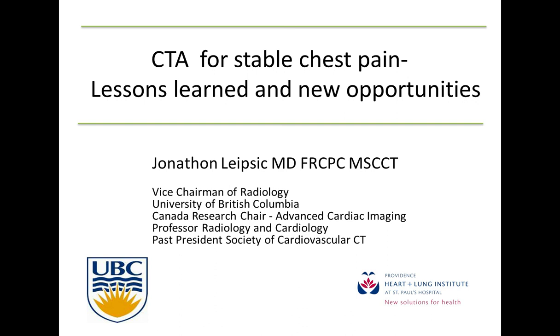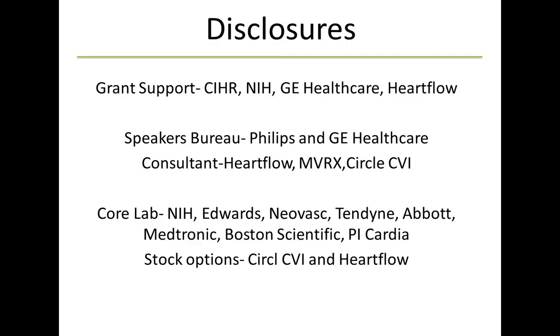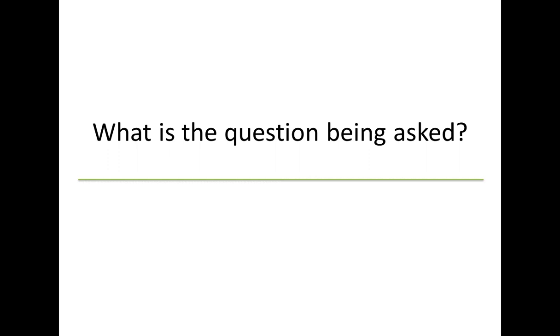So the reason I'm such an advocate, I believe, for CTA, and why the European Society of Cardiology recently updated their chronic ischemic heart disease or chronic coronary syndrome guidelines to provide a class 1 indication for coronary CTA, is because I think it really helps answer in a very direct fashion the questions that are being asked when we're confronted with patients with symptoms suggestive of possible but not yet confirmed coronary disease.